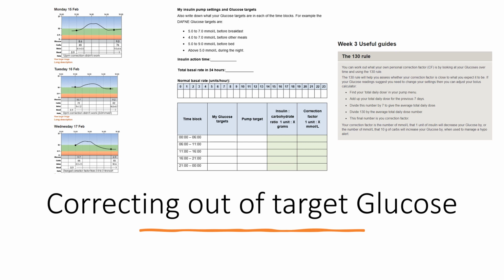We refer to taking 10 grams of carbs for hypo alerts, below target glucose but not hypo, at other times of the day, for example, before bed. Information on hybrid closed loop users differs as the system will compensate for a glucose below target, so additional carbs may not be required.